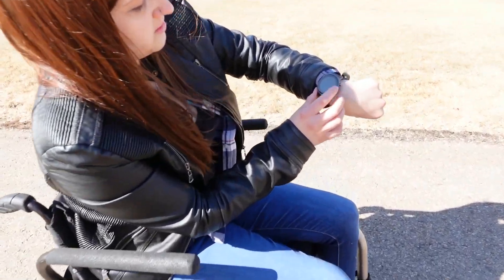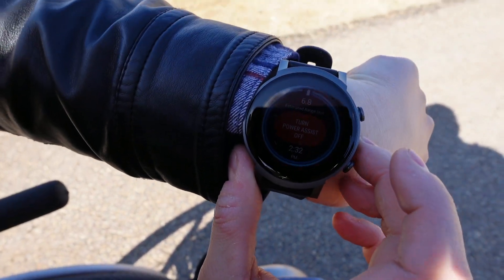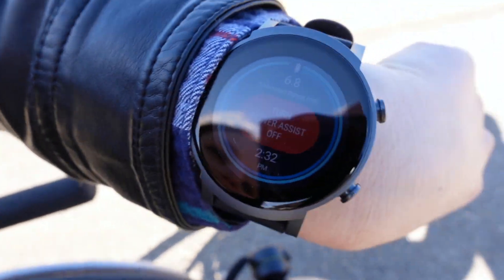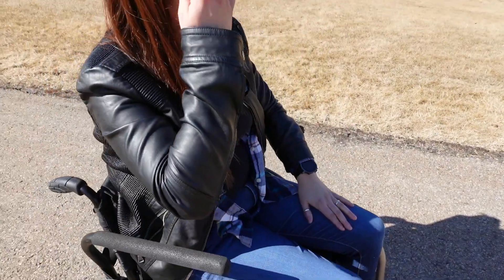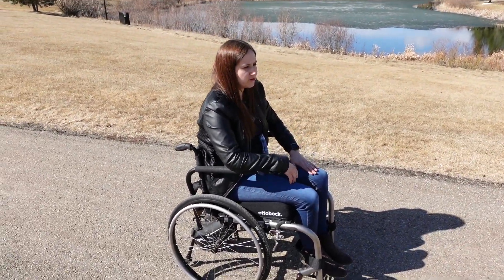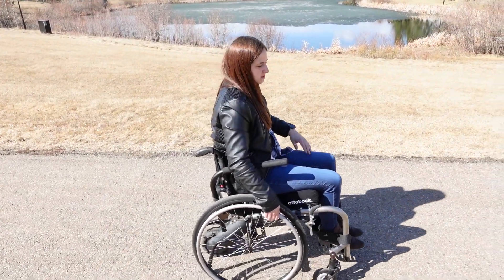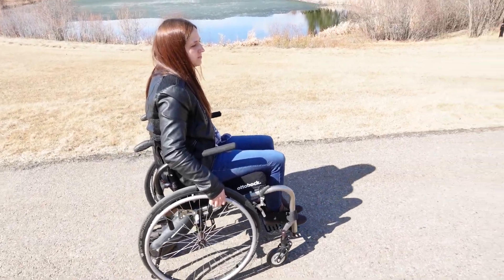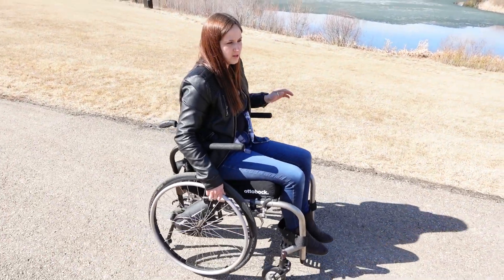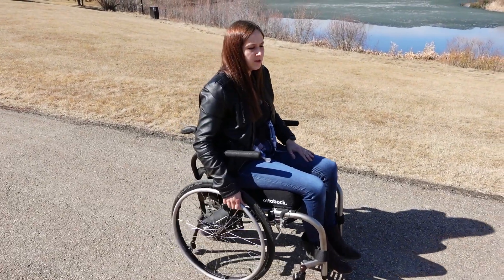First, you've got to click the button on the SmartDrive. So you click the button and it says 'turn on power assist.' It's got a watch and you turn on power assist — it'll vibrate on your wrist too, so you'll know. So you just tap your leg twice and that gets it going. Just locking it in — tap twice to turn it off. So you just tap your leg. Look at that momentum — you can go. It'll pick up speed.